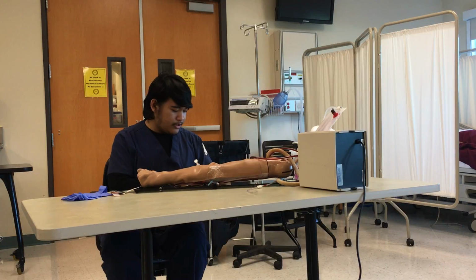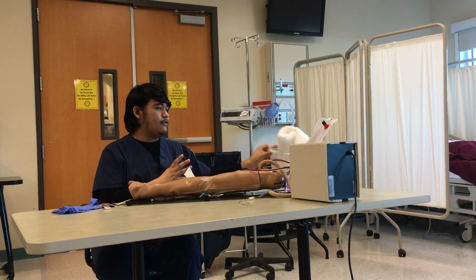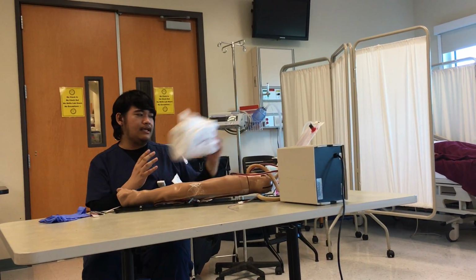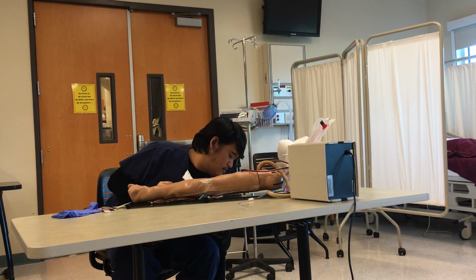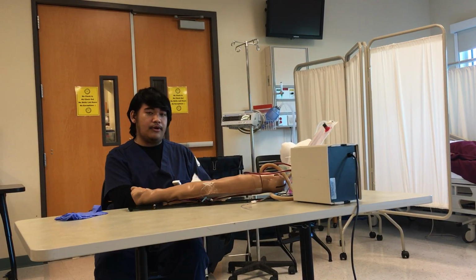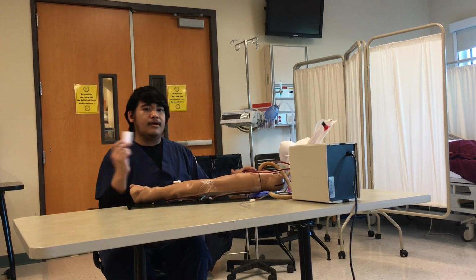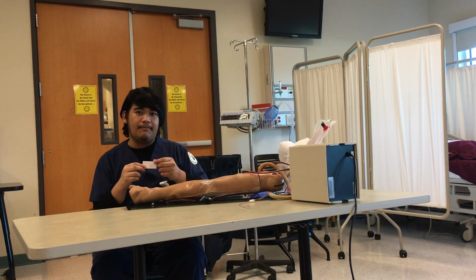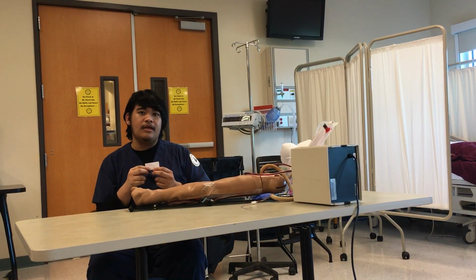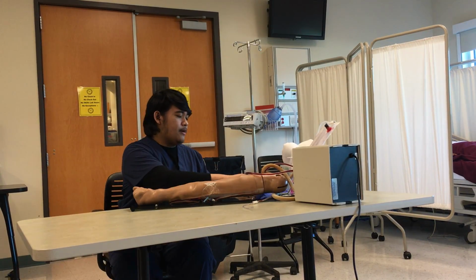We also need to make sure that we have an ice slush just in case we can't run it within 15 minutes, and a towel just in case we need to find the radial or the place where we are going to do the procedure. Once we have all the equipment, I'm going to fill out the requisition slip with the patient's name, the patient's temperature, FiO2, the time that I did the arterial blood gas test, and the room number.